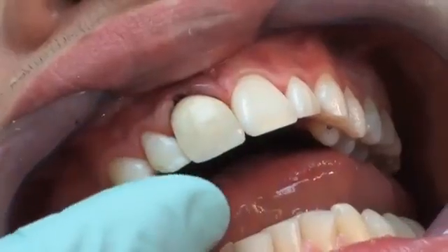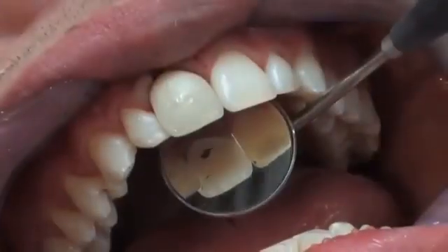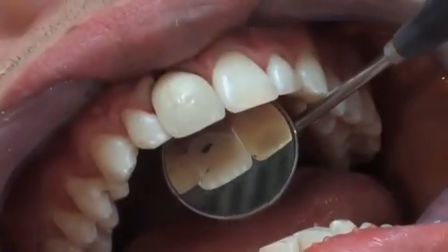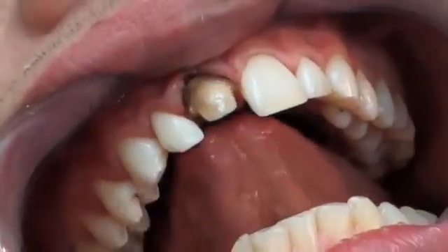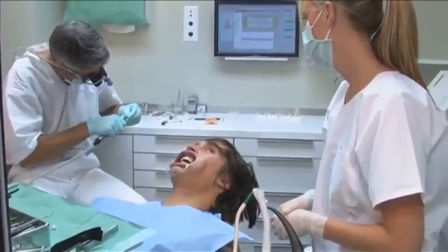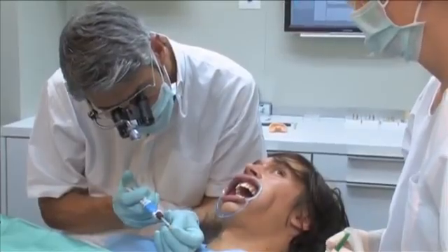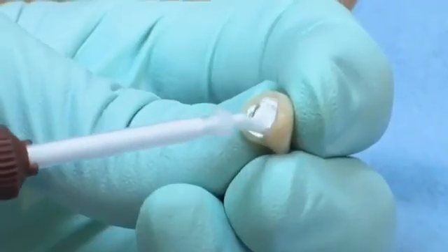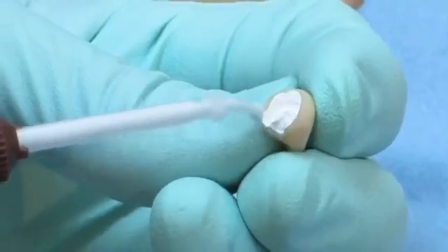Excess material is removed using rotary instrumentation. The occlusion is checked and all unnecessary contact points are removed completely. The completed provisional crown is cemented using TempoSyl 2, a radiopaque temporary cement based on an addition reaction silicon.